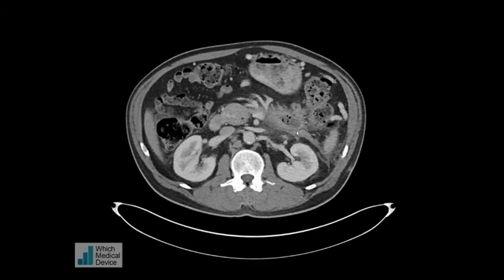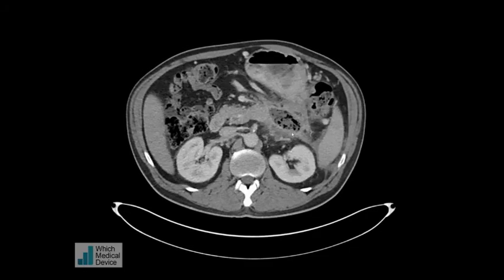So at this point we need to go on and do an intra-arterial angiogram and see if we can confirm the splenic artery as the source of bleeding.